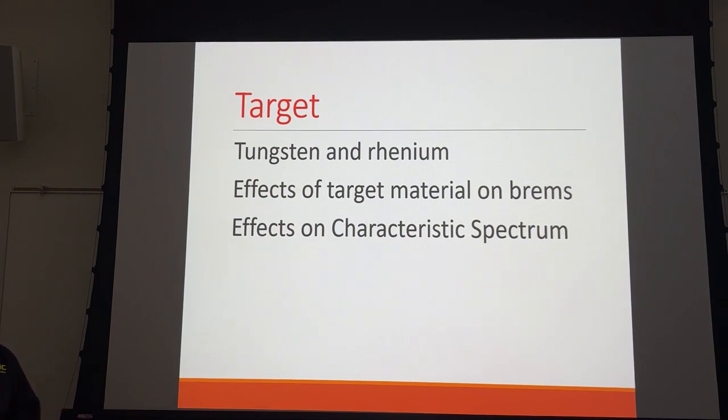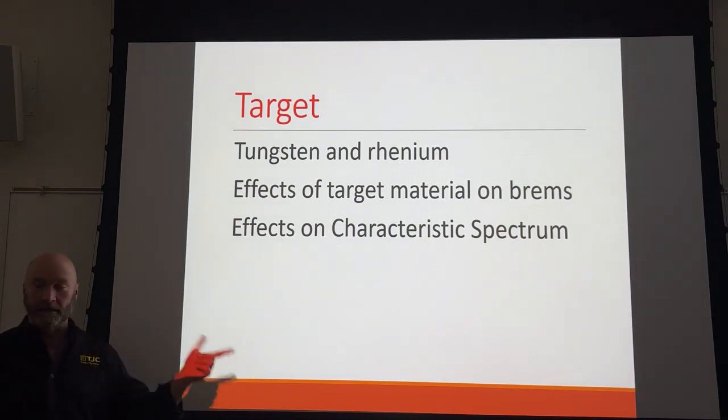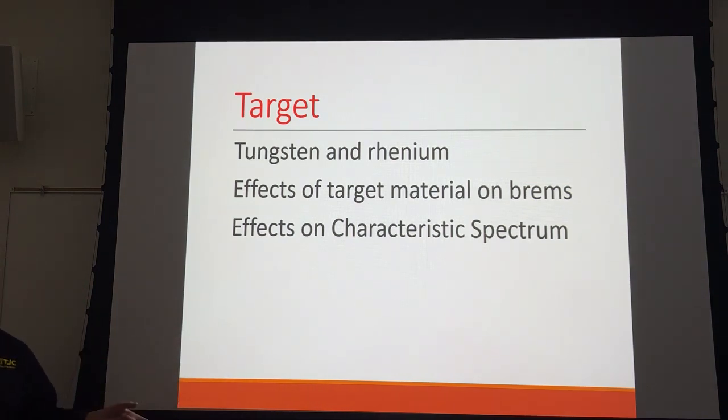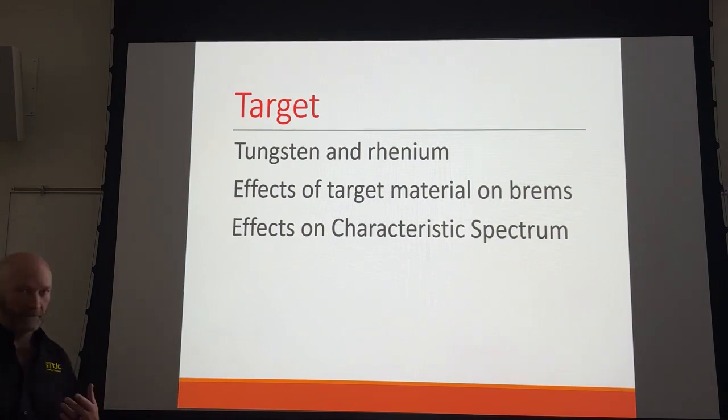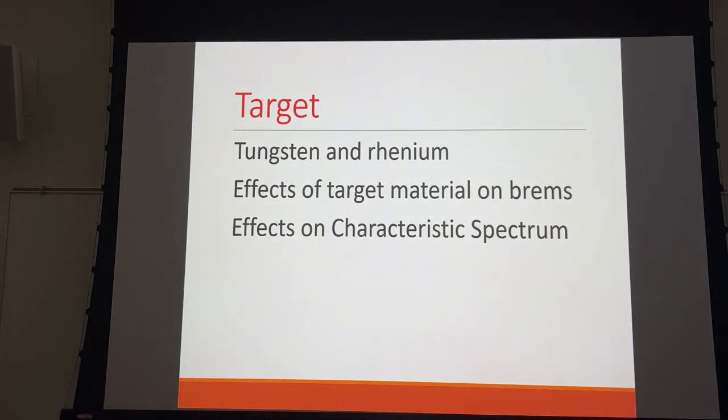For example, if they're doing a cholangiogram, a study for gallstones, they're going to inject some contrast. They're going to want you to shoot, but you've got to coordinate with the surgeon and the anesthesiologist. The anesthesiologist is going to have to suspend respiration so you can make an exposure. If you're not on the prep button, then you're going to kind of miss it. So there are times that you have to depress the prep button for an extended period of time.